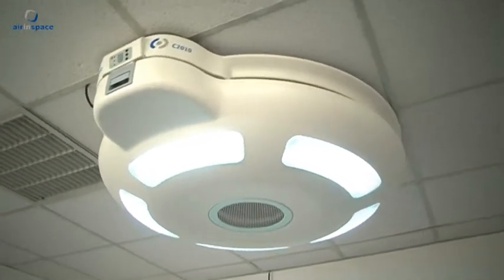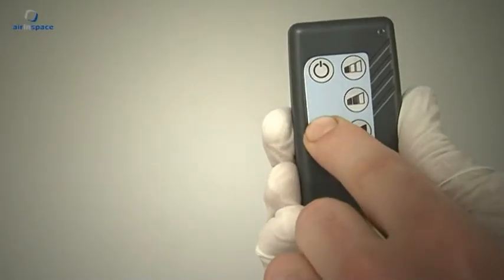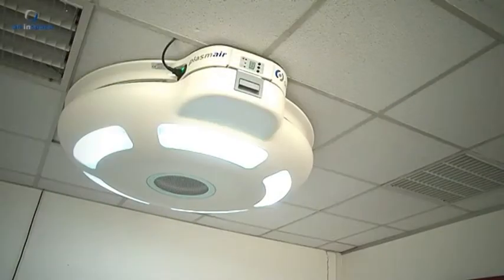The Plasmair C2010 is fitted with five light strips on its underside. The lights can be switched on either using the remote control or by pressing the button on the panel.